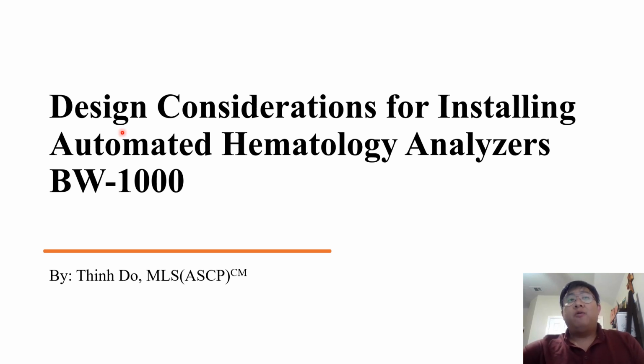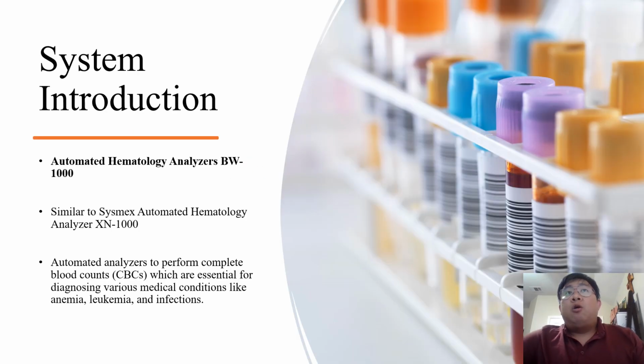Today's topic is design considerations for installing the automated hematology analyzer BW-1000. First, we take a look at a brief introduction for the system.